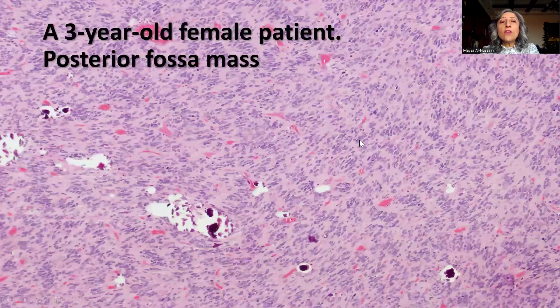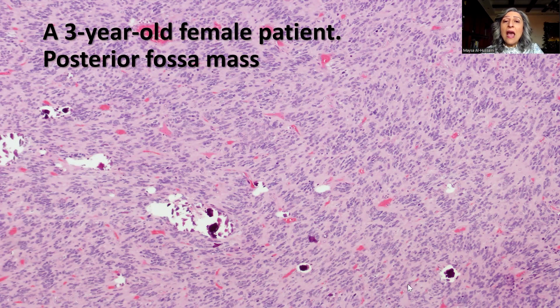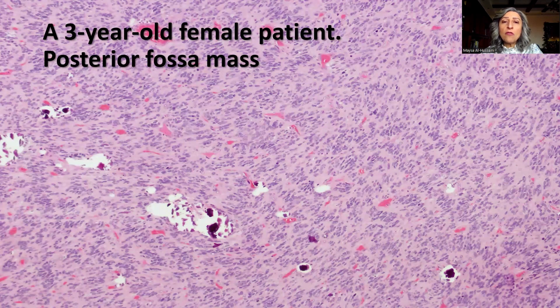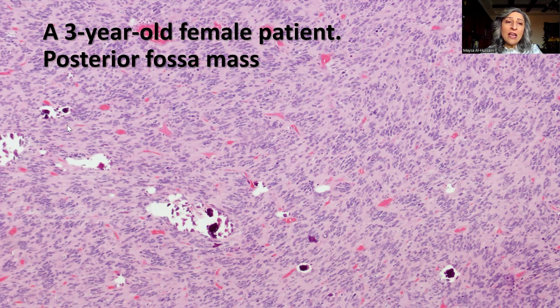This is a case of a three-year-old female patient who was found to have a posterior fossa mass that was resected. As you can see from the low-power magnification, this is a fairly cellular tumor with a proliferation of spindle to round blue cells, with scattered areas of calcifications and rich vascularity.